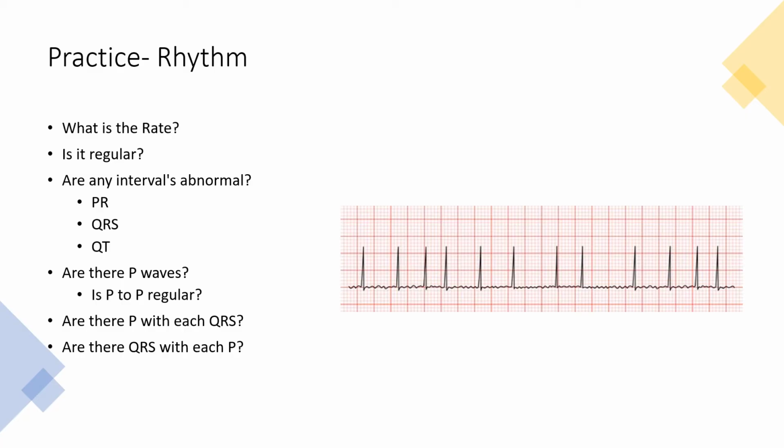Next, let's check the QRS complex. This appears to be narrow, approximately 40 milliseconds, but way less than 120, so this is okay. Finally, the T wave does not appear to be present, as it's likely masked by whatever electrical activity is occurring in the atria with this strange fibrillating electrical activity that's occurring between each QRS complex. So I can't assess the QT interval on this lead. You could potentially look in another one if you needed to.